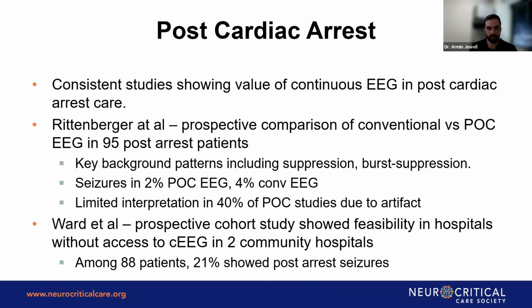Lastly, post-cardiac arrest. For most people who are aware, especially in the Neurocritical Care Society, certainly EEG in post-cardiac arrest care is a significant and important component of the treatment strategy and prognostic value. And so you might imagine if conventional and continuous EEG does have prognostic value, that point of care EEG would also.